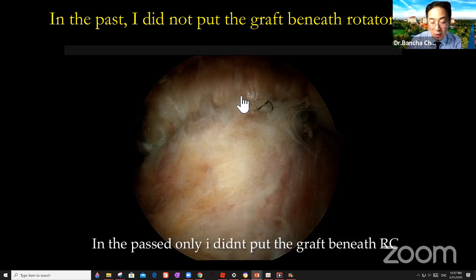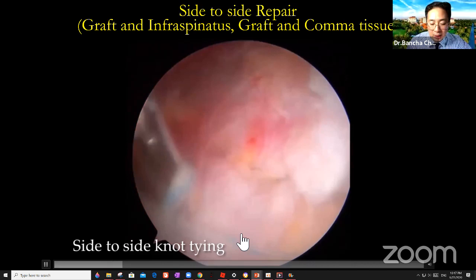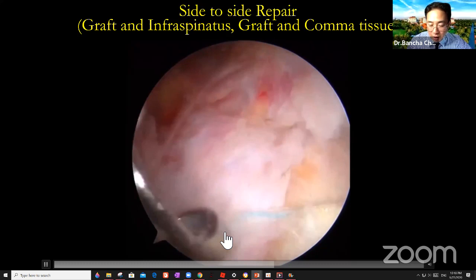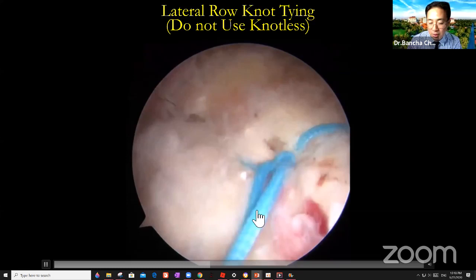The next step is to make the repair side to side. This is at the distal part, okay? Repair the graft to the infraspinatus in the back and repair the graft to the comma tissue or the rotator interval in the front, okay? Like that way. So after that, we tie the knot. This is at the greater tuberosity. We tie the knot, okay, one by one.